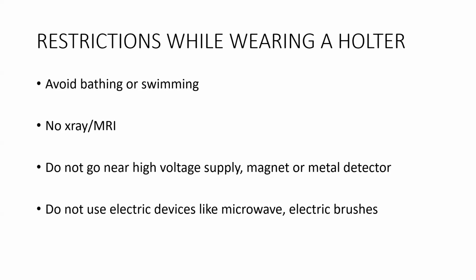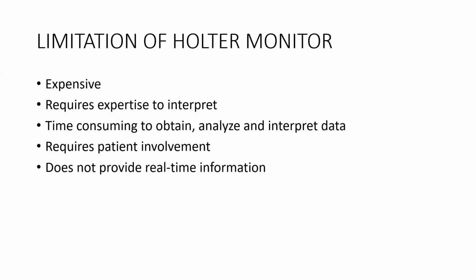So one, it's more expensive than an electrocardiogram. It requires expertise to interpret. It's time consuming. It will take a whole day or more to obtain the data, analyze, and interpret.